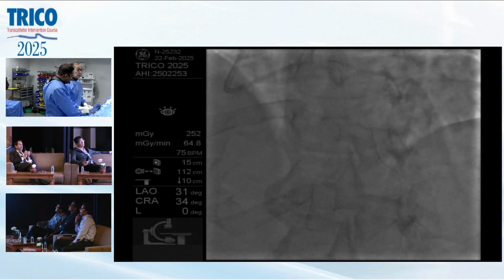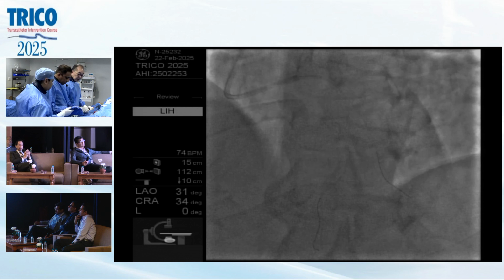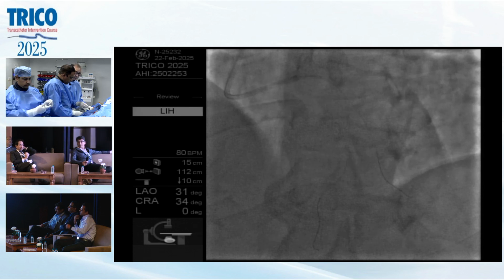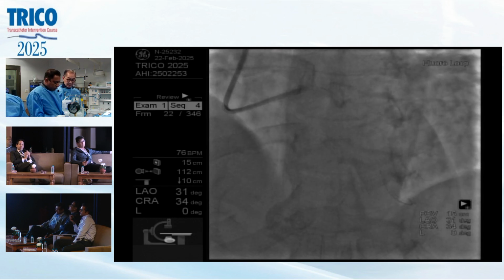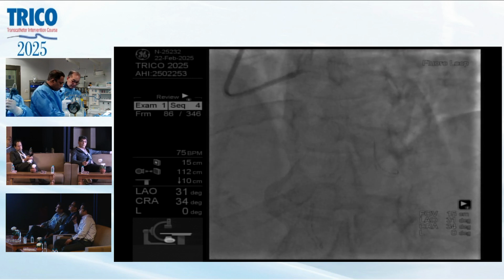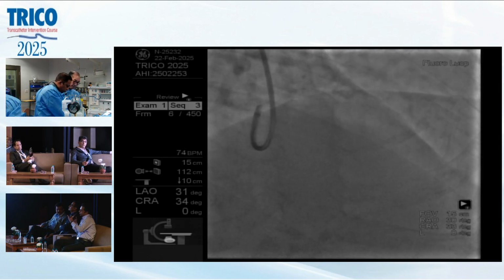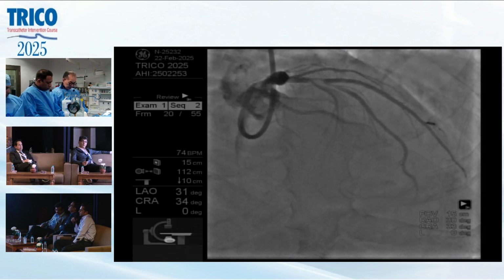How about a stent in the main branch and a drug-coated balloon in the big diagonal as a provisional strategy? Ordinarily, Taka, with you, we would all have, in the US, probably done a two-stent approach here, but now with DCB availability, I ask my colleagues on the Indian side of the panel, DCB in the diagonal? Yes, certainly. Even if not DCB, I would probably do a final kissing balloon and provisional stenting only for the diagonal.